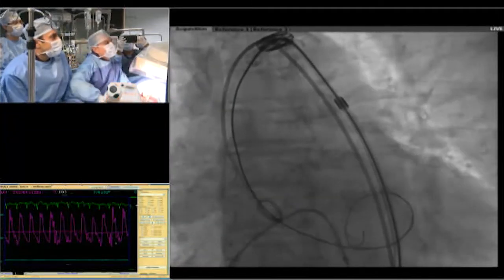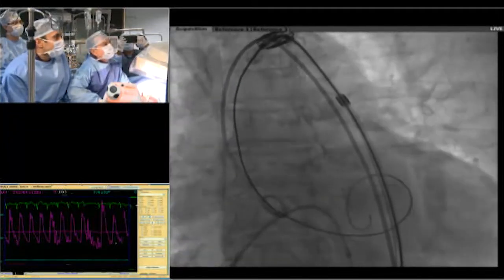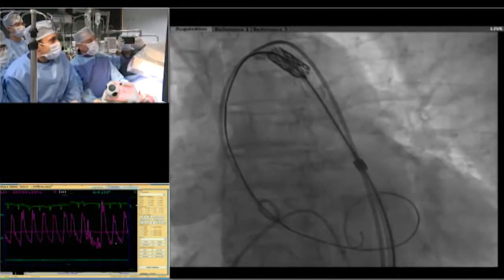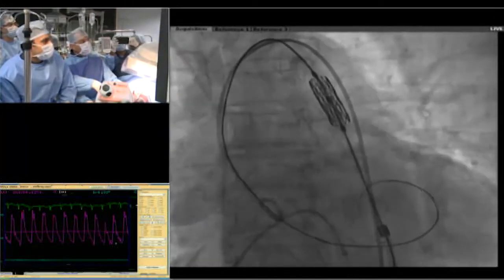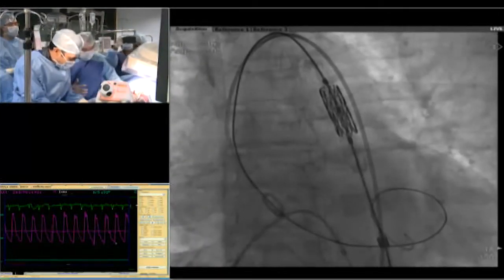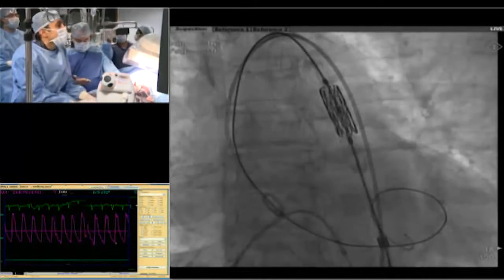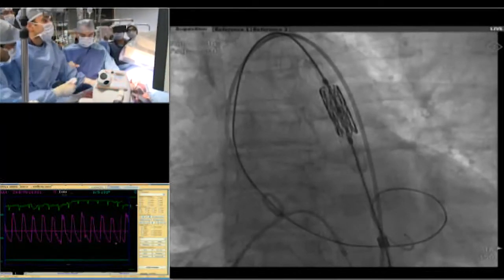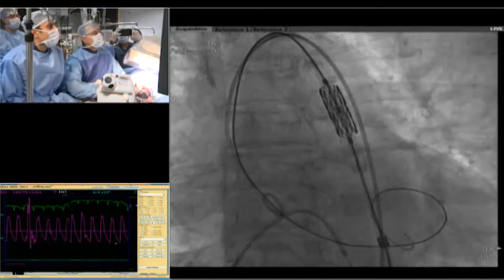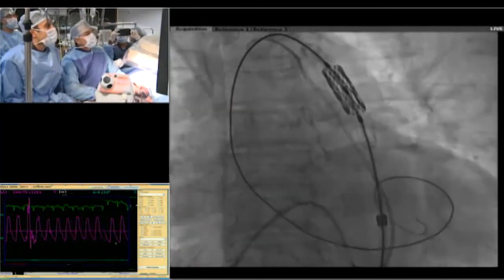My hands are slipping. Okay. So give me 1 minute here. Let's come out, let's come back again. Just push the wire a bit. No, don't torque it more. I don't want wet. I want dry because my hands are slipping. Okay, let's try to go in again. Maybe what we can do is let's fluoro. Let's go now.